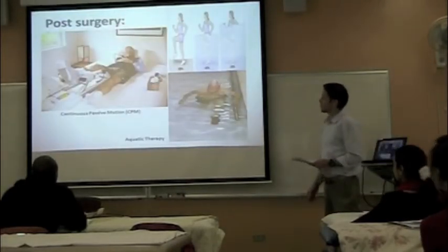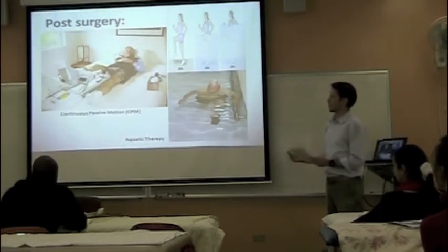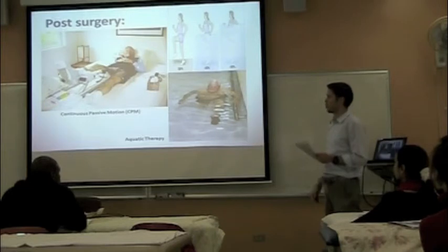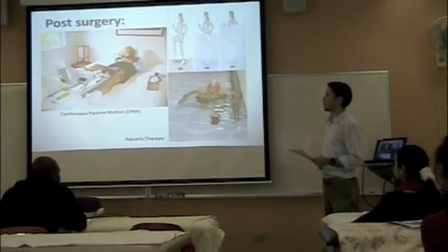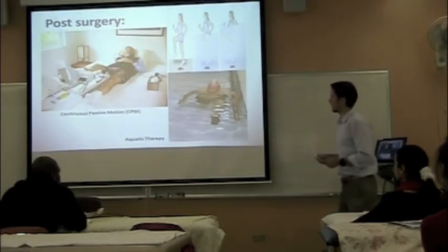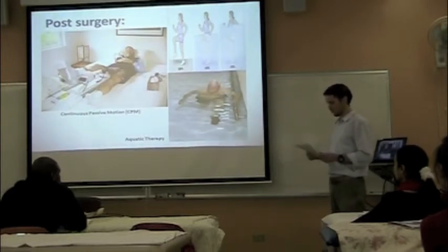There's something called a CPM, a continuous passive motion machine, where literally the day after surgery, the affected leg will be hooked up to this machine. This will passively, without any effort from the patient, move him through various degrees and ranges of motion to keep it moving, because an excessive buildup of scar tissue will inhibit movement later on. And then also aquatic therapy, that can only be done once the incision is actually healed.